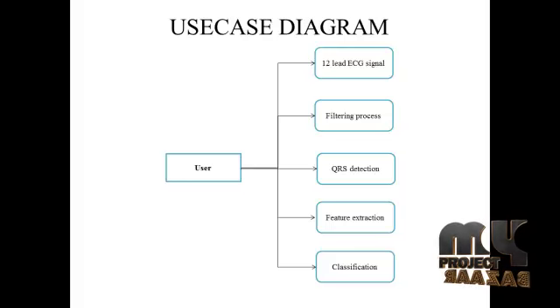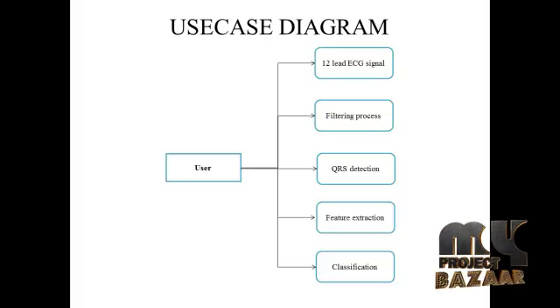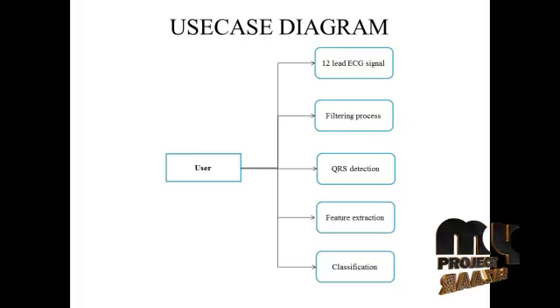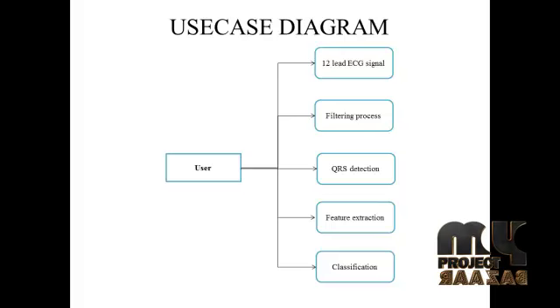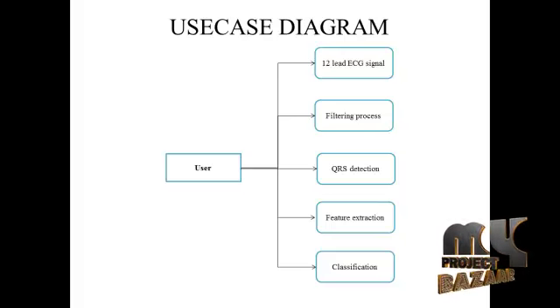The project flow diagram is to measure the 12-lead ECG using atrial wave detection. We have to collect the dataset. The datasets are text or DAT files. From that dataset, we choose one DAT file or signal. It is our cardiac signal. It is also our input signal.